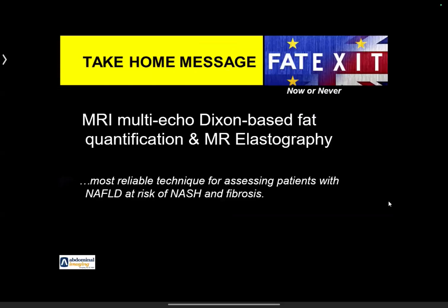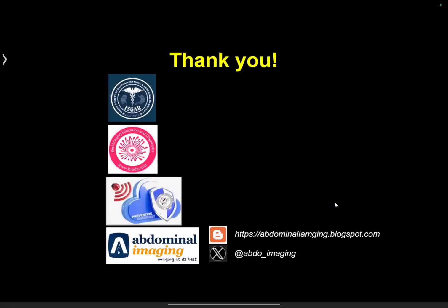So I'll end here. The take-home message is not Brexit, but the fat exit is what we focus on. Multi-echo Dixon-based fat quantification and MR elastography are the two accurate tools one can rely on. So you can quantify fat, quantify fibrosis, and add appropriate intervention in the patient's treatment.